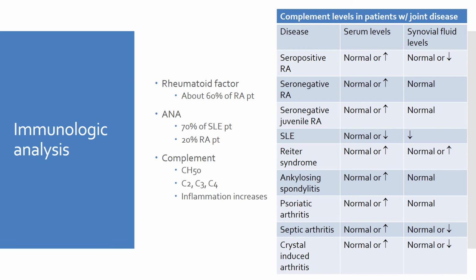Now, synovial fluids we frequently do testing for, because joints and joint disease are associated with certain immunological diseases. So we do frequently get requests for immunologic assays on synovial fluids. Those diseases mostly include rheumatoid arthritis and SLE, which have a pretty significant impact on the joints, as well as a couple of other arthritic conditions. But the two most common are really SLE and rheumatoid arthritis.